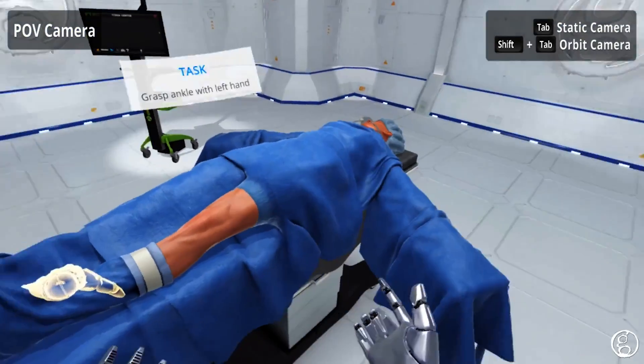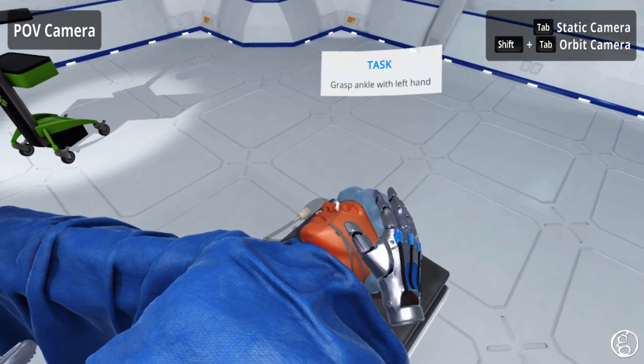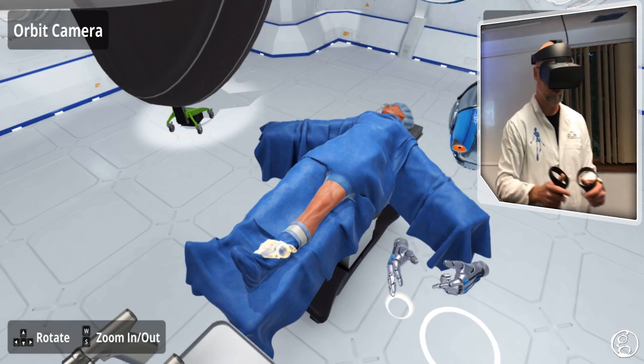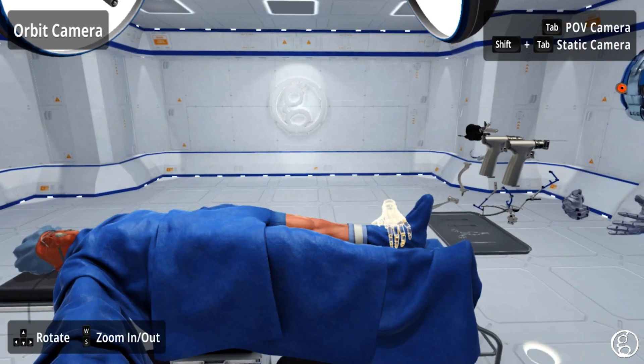I'm also in what's called room scale VR, so I can walk around the patient. I can walk up to the patient's head and walk around to the other side of these tools at the other side of the patient too.